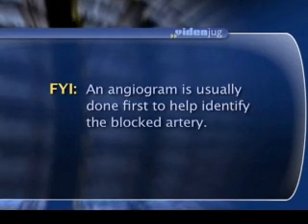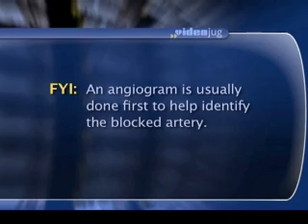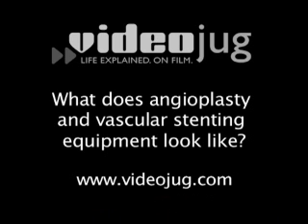What a patient can expect when having balloon angioplasty or stenting performed is the possibility of mild pressure while the balloon angioplasty is being performed. Other than that, very little pain should be experienced by the patient. What does angioplasty and vascular stenting equipment look like?